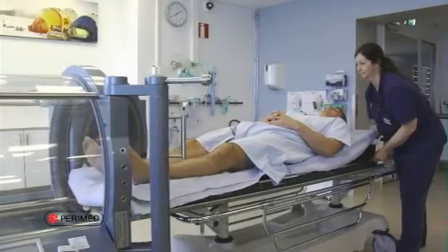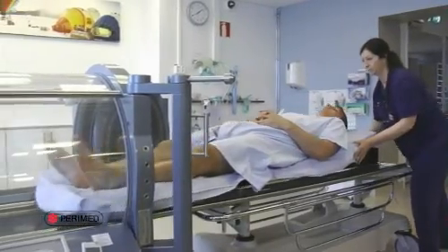Lastly, let's discuss predicting benefit from hyperbaric oxygen therapy. Transcutaneous values obtained while breathing normobaric air cannot be used to predict benefit from hyperbaric oxygen therapy. The sea-level oxygen challenge test is also not an accurate predictor of hyperbaric benefit. The best way to predict benefit from hyperbaric therapy is using in-chamber TCPO2.